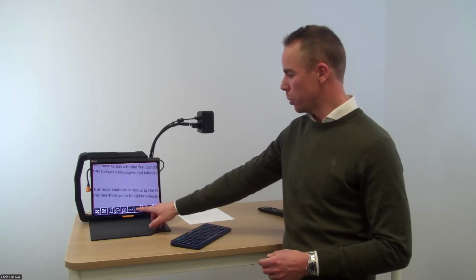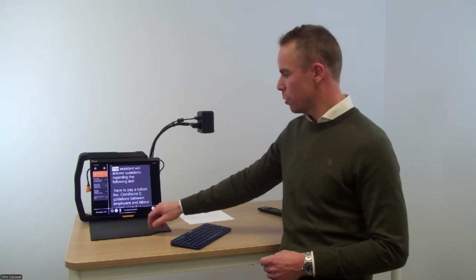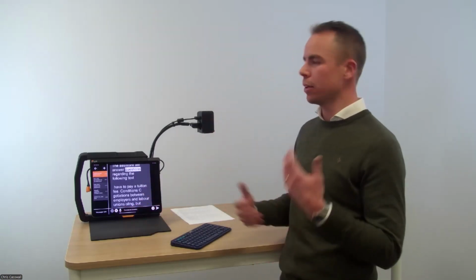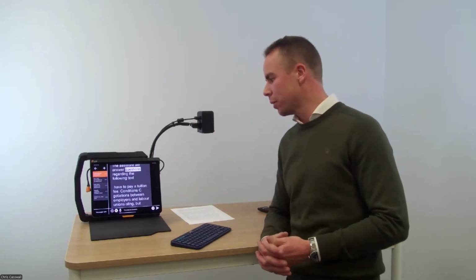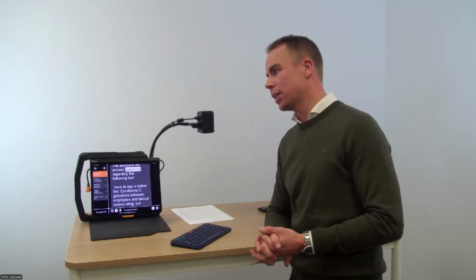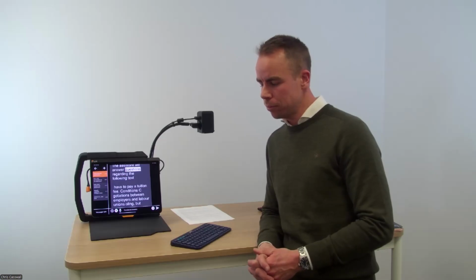By doing the long press, I don't have a good text here now, but let's do it anyways. The assistant will answer questions. I scan and bring over that text. You can kind of say that it's OCR as well. I don't know exactly the terms, if it's correct or not to say it is, but they do play together, but not necessarily. Probably not the best answer, but maybe... No, that's a clear answer. So like he said, they will work together, but no, they're not.